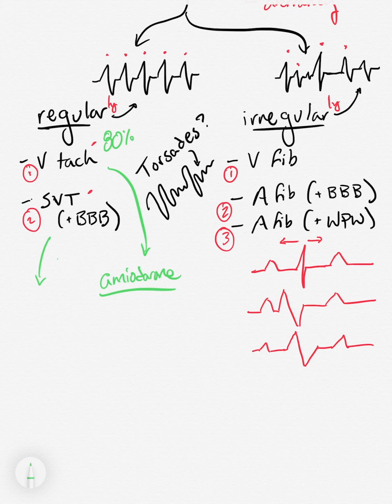But again, look for that bundle branch block, which we know that we can see in V1 and V6 with the M's and the W's, right? Not reviewing that right now. That's a different video. SVT, though, the very most important thing you can do is a lot of times these cases might resolve themselves just by having the patient go supine and elevating their legs. Let's throw his little arms out there so that he's clearly flailing.